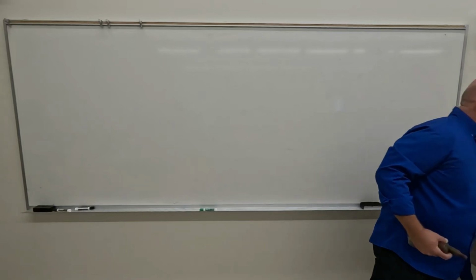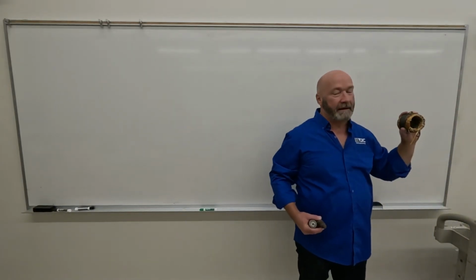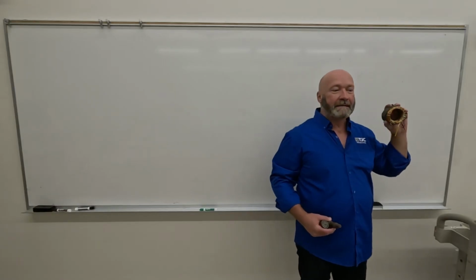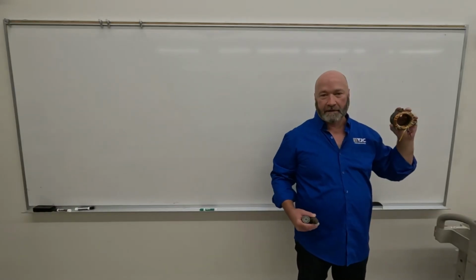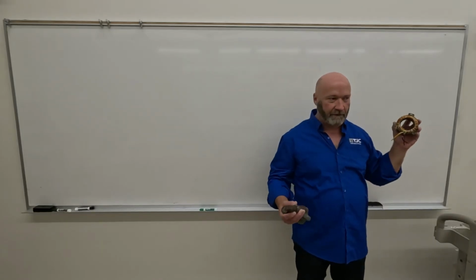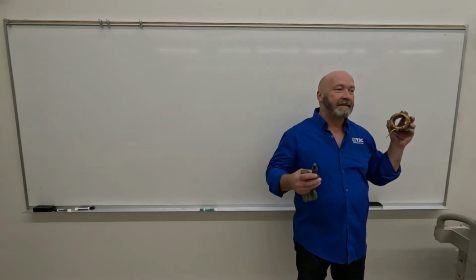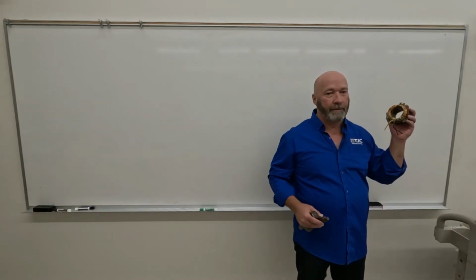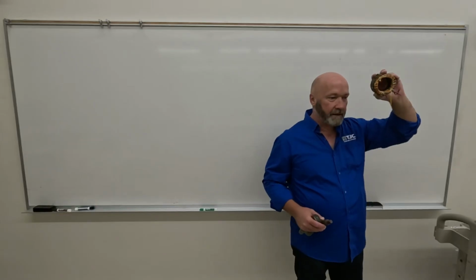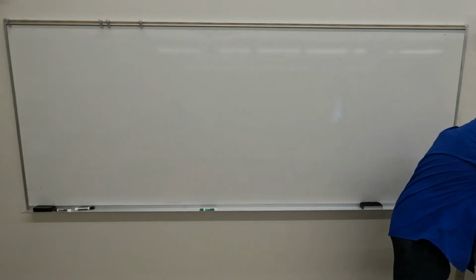You've seen this before. That's an induction motor. This is considered to be a part of the X-ray tube, even though it is not inside of the X-ray tube. Okay, so just file that away. You'll see questions from now till the registry that say the only part of the X-ray tube that is outside of the glass or metal envelope is the induction motor. So just file that away and don't miss it on the test.